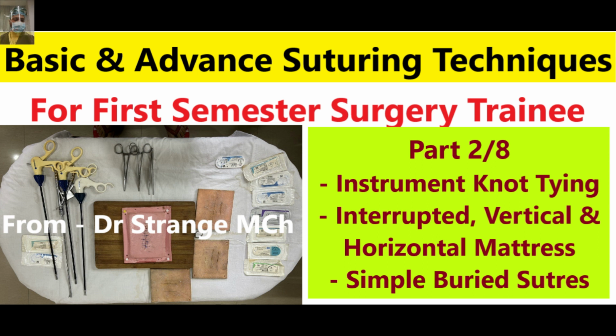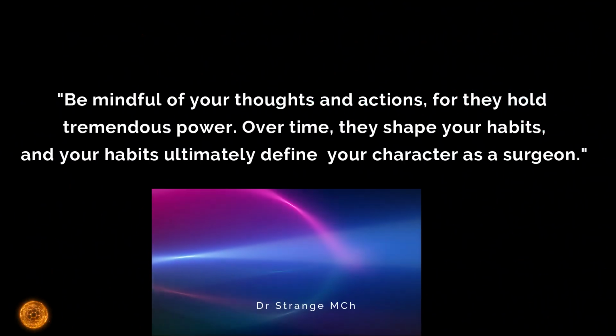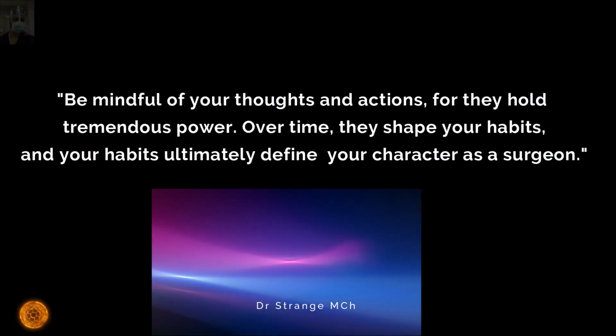I am Dr. Strange, and today we are diving right back into the world of surgical skills. In our last video, we explored the fundamentals of suturing, what is the basic setup, and today we are taking it up a notch higher with advanced suturing techniques.